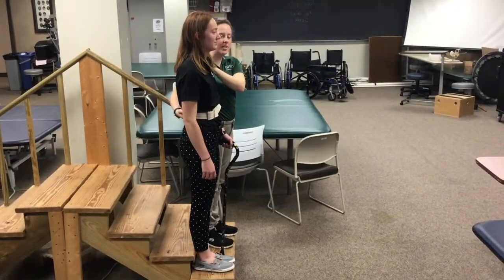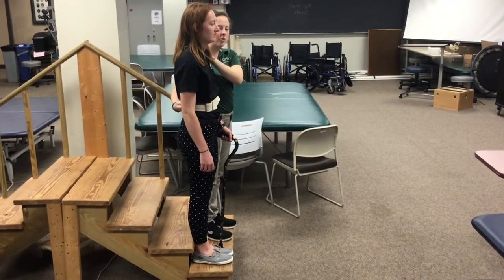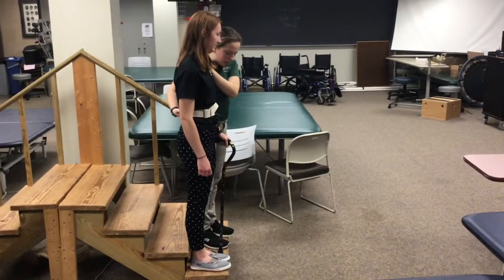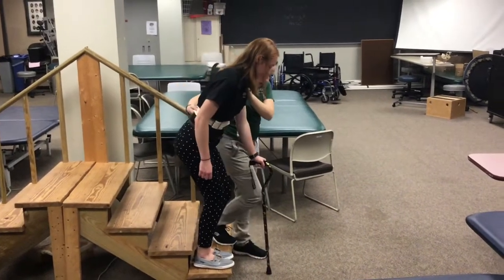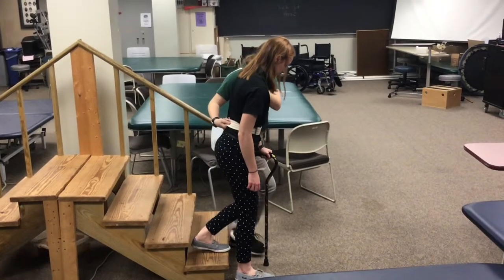Now we will cover how to descend a curb. You'll begin by standing in stride with your patient with a hand on their shoulder and a supinated grip on their gait belt. So can you move your cane down first? And then bend your uninvolved knee to lower your involved leg, and then step with your uninvolved.